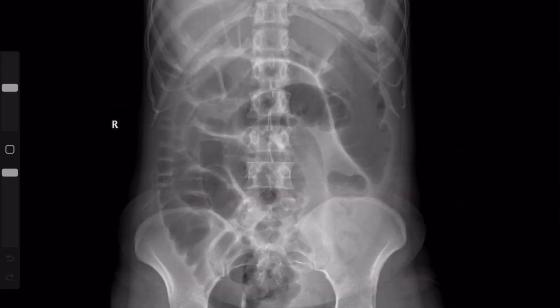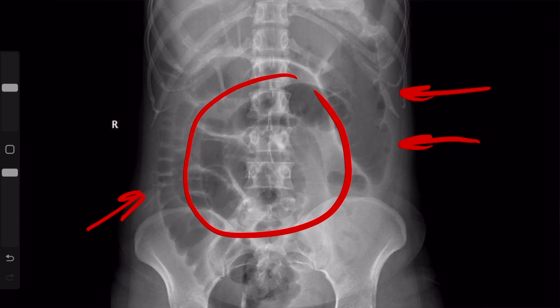Contrasting this with a large bowel obstruction — notice again you have gaseous distension of multiple bowel loops. To tell small from large bowel: small bowel is located centrally, and we do have some distended small bowel loops here. With the colon, you see these haustral markings, which I'm outlining here — these are characteristic of the colon. If you see haustral markings on a dilated loop of bowel, that is dilated colon. In this case there is a large bowel obstruction, with secondary dilation of the central small bowel loops, while the peripheral bowel loops are dilated colon.